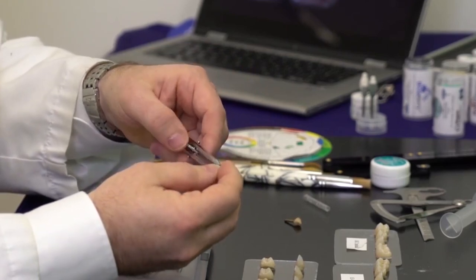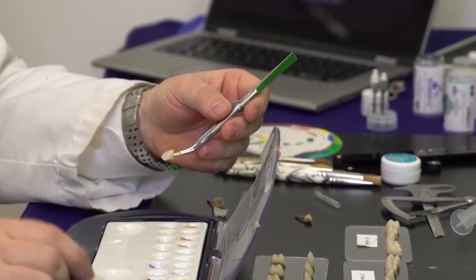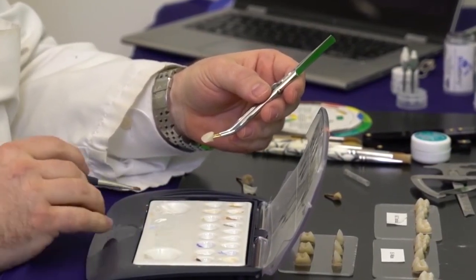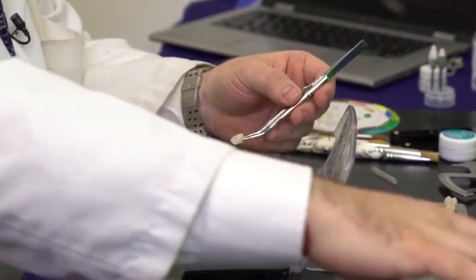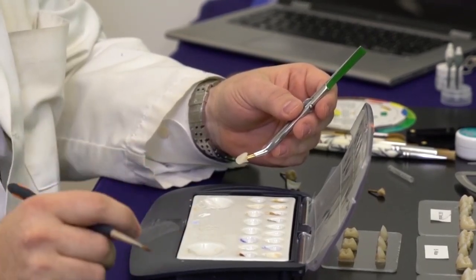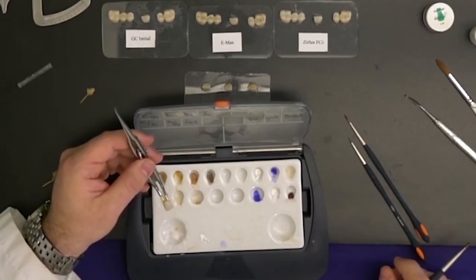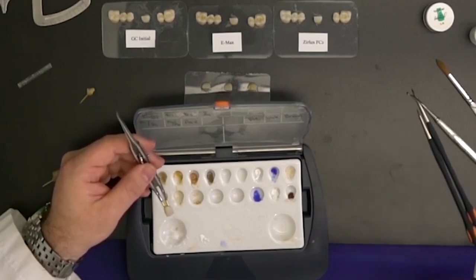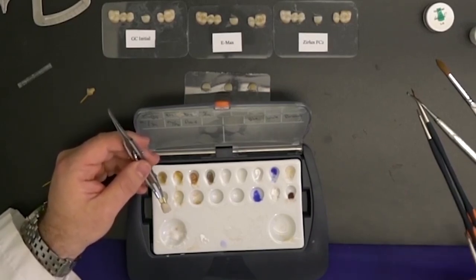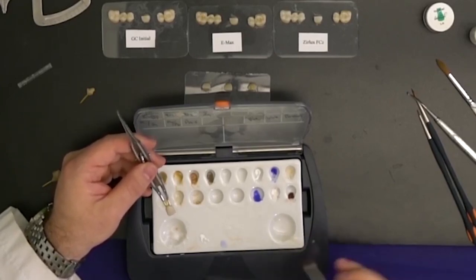I use these reverse grippers because it becomes very easy to manipulate the restoration. I've prepared my palette — in this demonstration I'll be using the luster paste. I have diluting liquid as well as neutral and some of my colors. For this we'll be using the LA to achieve a similar shade to perhaps an A3. I mix the neutral with the stains, which gives you control of being able to glaze properly. With luster paste, the consistency has to be rather thicker, and mixing it with the stains makes it easier to control placing the glaze and stain.